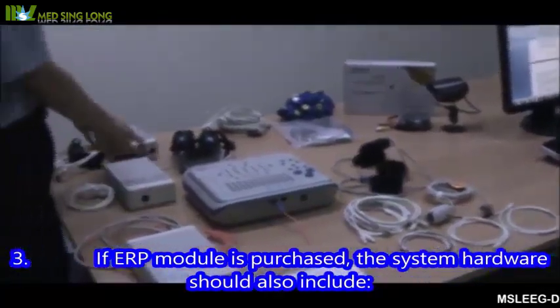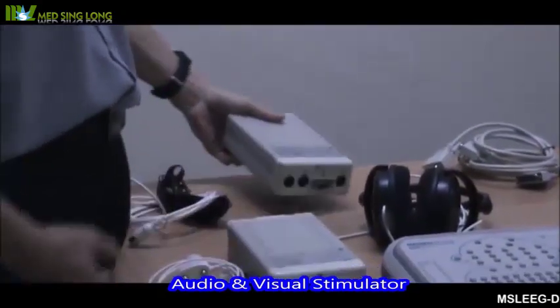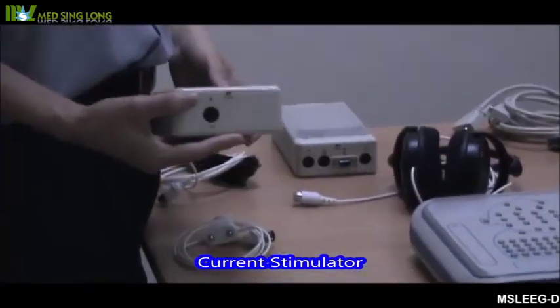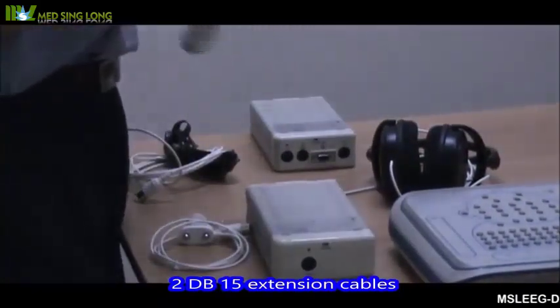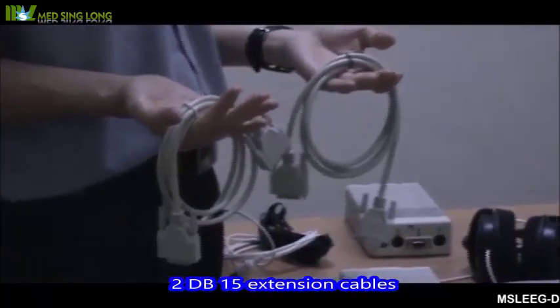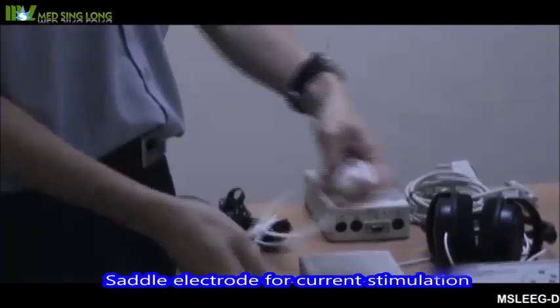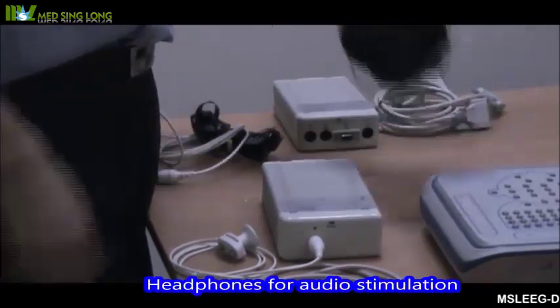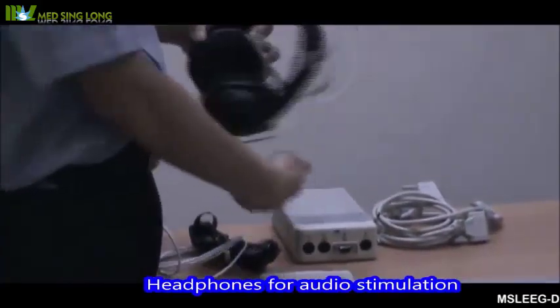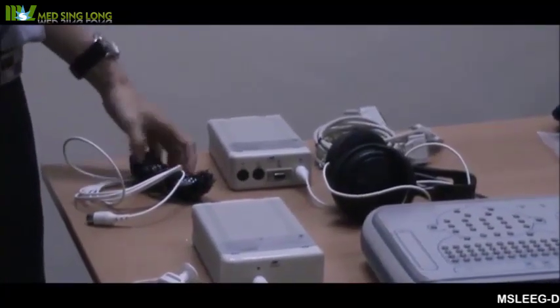3. If ERP module is purchased, the system hardware should also include: audio and visual stimulator, current stimulator, two DB15 extension cables, saddle electrode for current stimulation, headphones for audio stimulation, and goggles for visual stimulation.